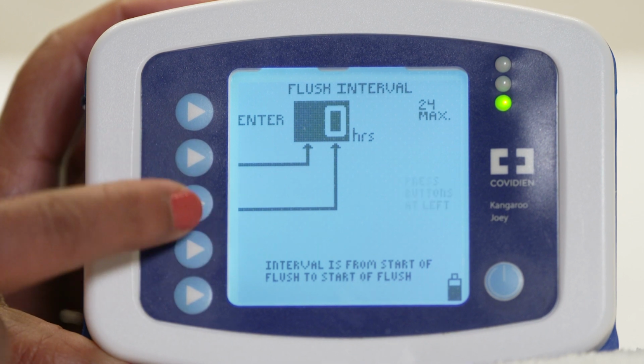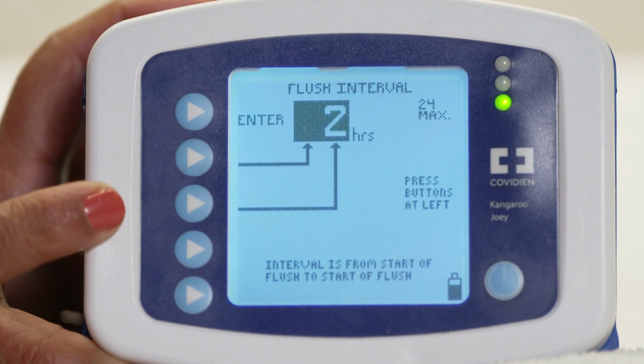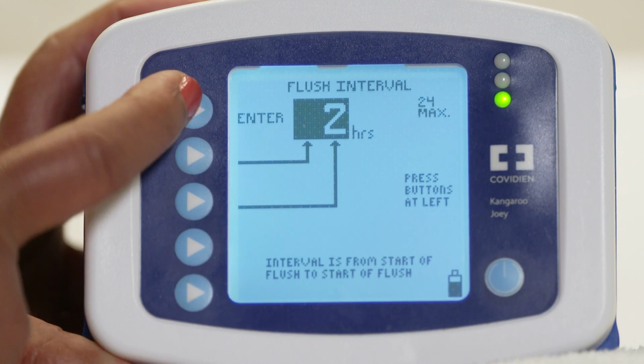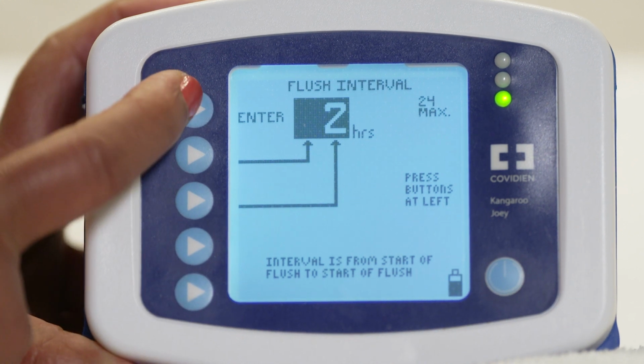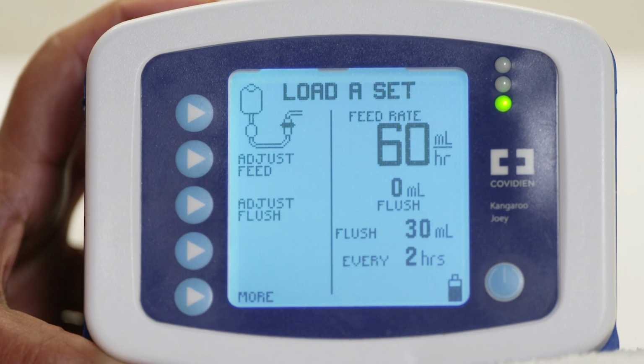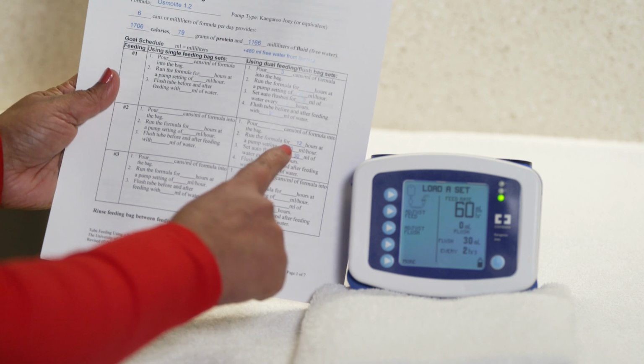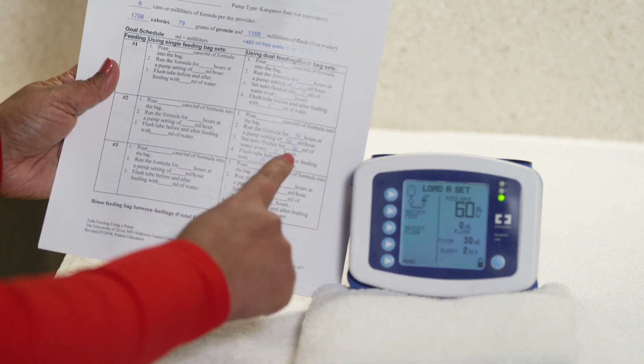Using the navigator buttons to the left, use the appropriate arrow to enter the prescribed hours for the flush. Press Enter at the top left corner. Press Done at the bottom left corner. Once the pump setup is complete, make sure that the written orders from your dietitian match the screen.